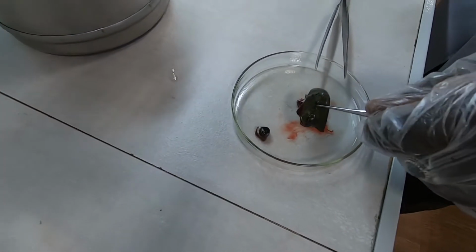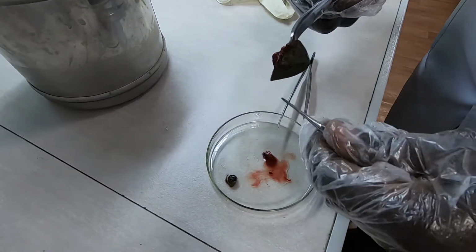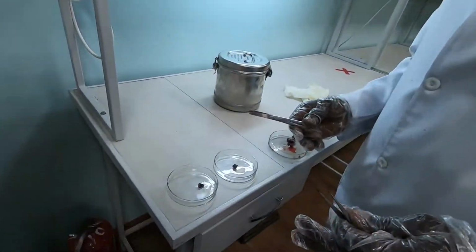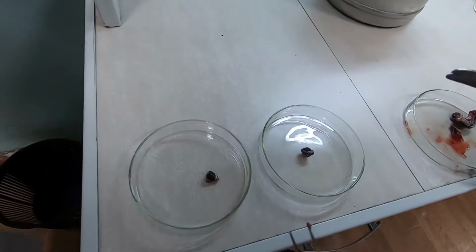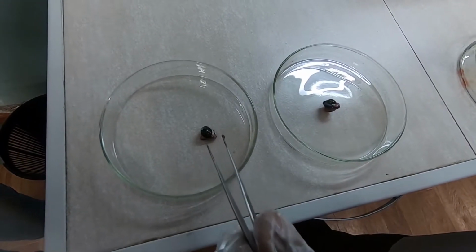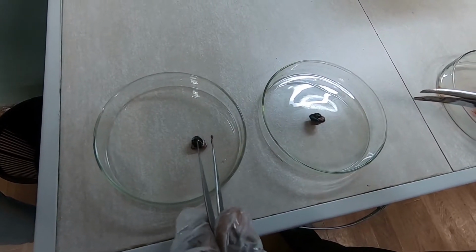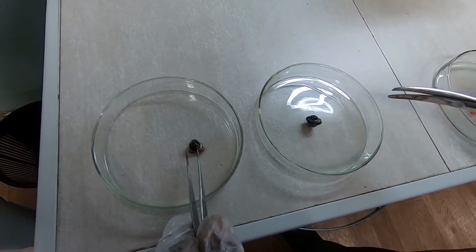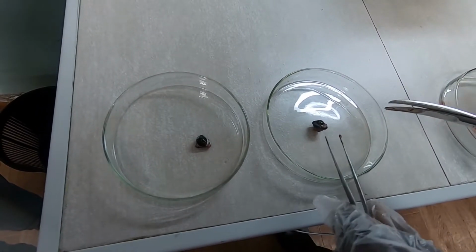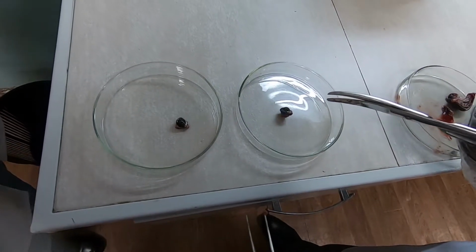This is the first eyeball. And we're going to do the same with the second one. Now you can see our eyeballs. These are the eyeballs of our typical frog. On one, we're going to apply solution of Ringer. And on the other, we're going to apply our usual adrenaline.